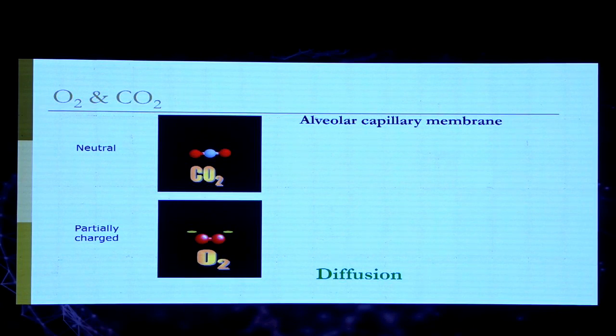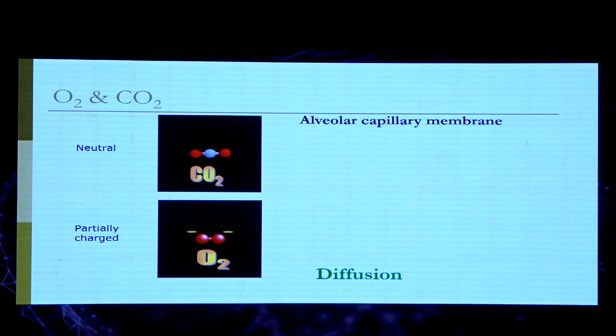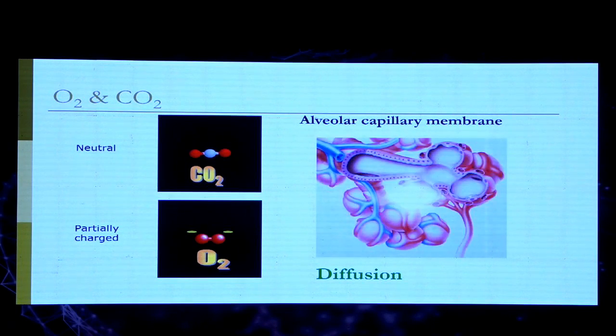What knobs do we need to adjust depending on oxygenation and carbon dioxide? That's the aim of ventilation, to oxygenate and remove carbon dioxide. The reason we approach oxygenation and carbon dioxide by using different knobs on the ventilators, even though they are both gases, is that oxygen is a partially negative molecule, whereas carbon dioxide is a neutral molecule, and neutral molecules are fat soluble. Since we're talking about diffusion across an alveolar capillary membrane composed of phospholipids and fat, carbon dioxide diffusibility is about 20 times more than oxygen.